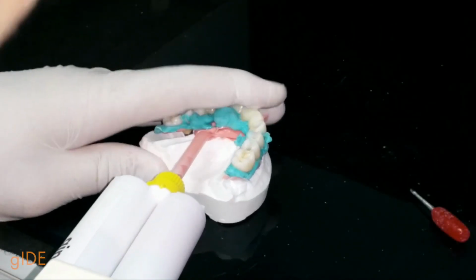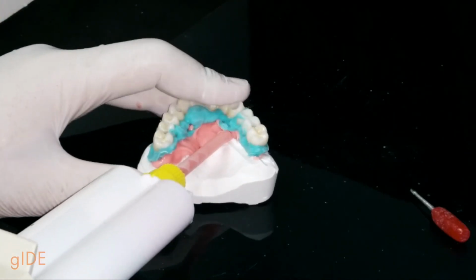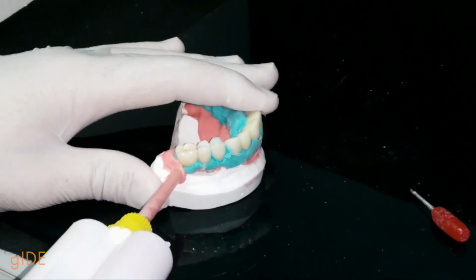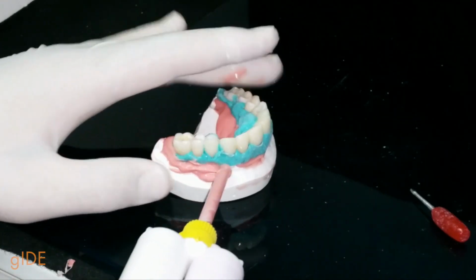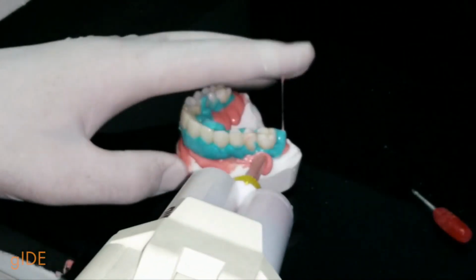Of course, we put the material also in the pontic area on the model in order to avoid any kind of bubbles, as you can see in the video. And in that way, again, we are able to have an ideal model, a model that maintains the reliability of the plaster in terms of 3D implant position, and at the same time the reliability of the silicone and the temporary restorations for the soft tissues.